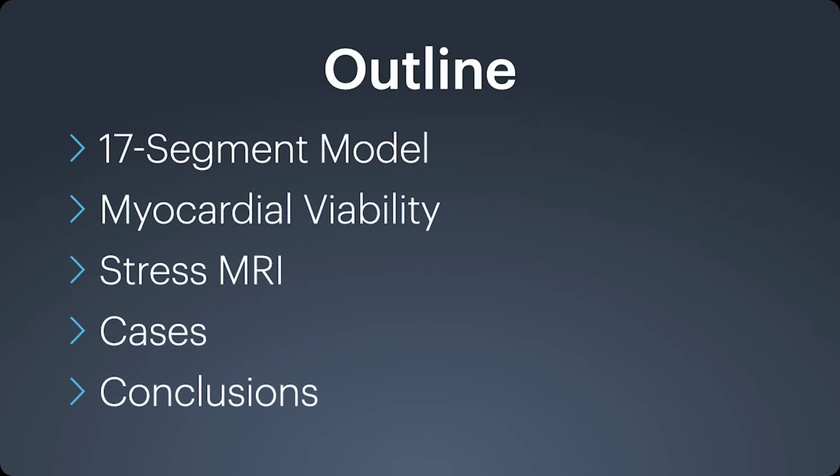So today we'll be going over the 17 segment model of myocardial description. We'll touch upon myocardial viability imaging, cardiac stress MRI. We'll then go through some cases and review some take-home points.